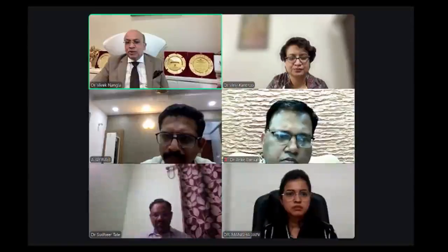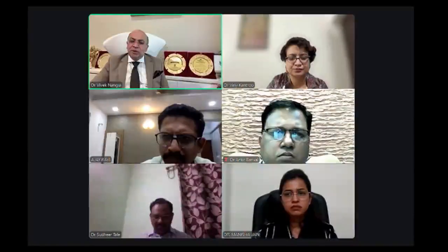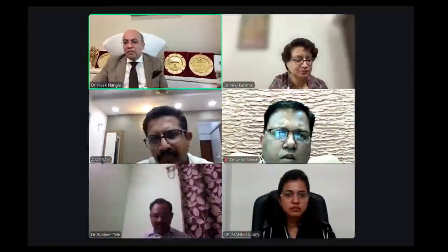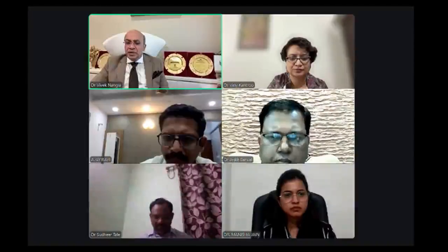I think the rest of the questions by Dr. Omkar have already been handled by Dr. Manisha. What is the role of fluoroscopy guided TBLB is asked by Dr. Mahesh from Bangalore. The role of fluoroscopy is basically to increase the yield by enhancing your localization of where you're taking a biopsy from. I think these are just the questions. The rest are all repetitions that we've already answered quite a few times.